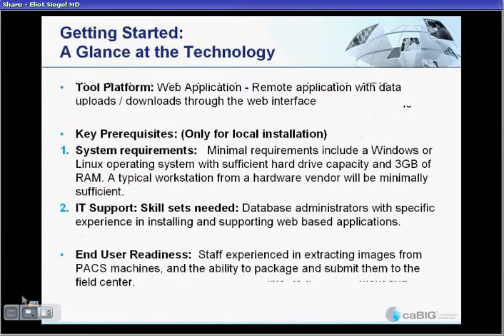We're also in the process of converting the largest collection that we have, the Rider LIDC collection, into an annotated collection, with those annotations being in the AIM format, which is the standard format of the imaging workspace.